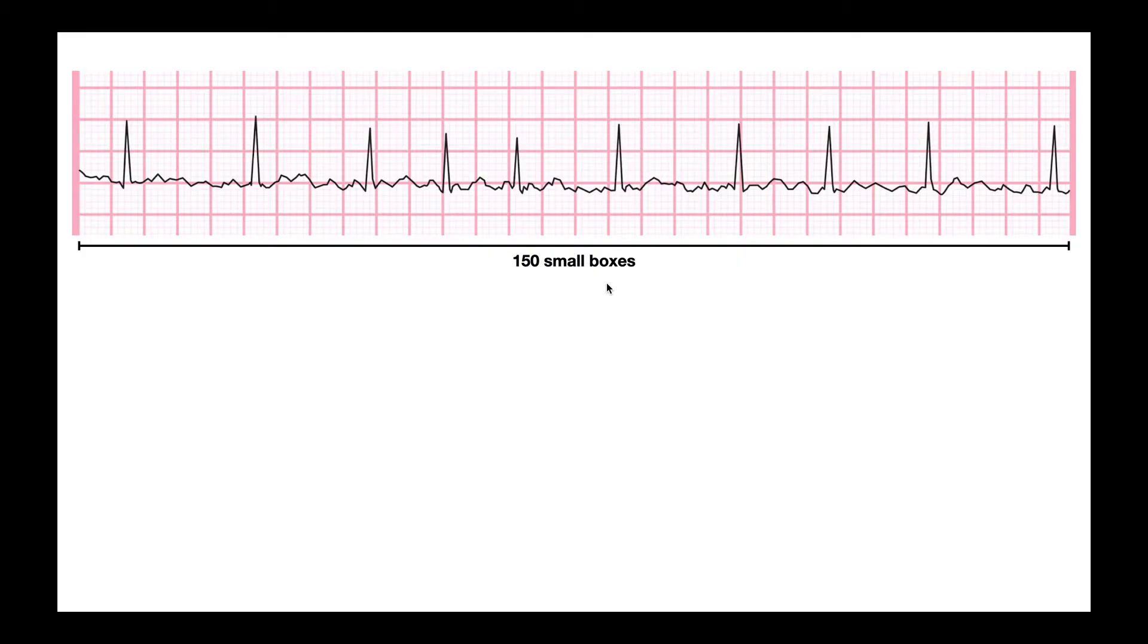The reason I mention that is because if you take 150 small boxes and multiply times 0.04 seconds, which is the time interval associated with each of the small boxes, you get 6 seconds. Remember, each small box is worth 0.04 seconds. So if there's 150 small boxes and each is worth 0.04 seconds, the entire length of this EKG strip is 6 seconds.